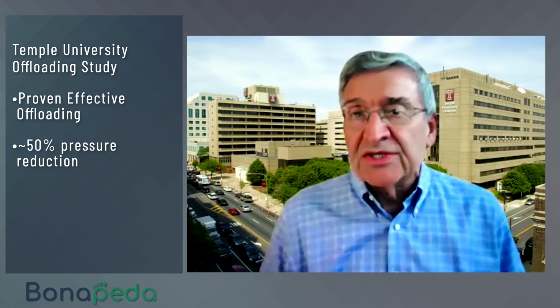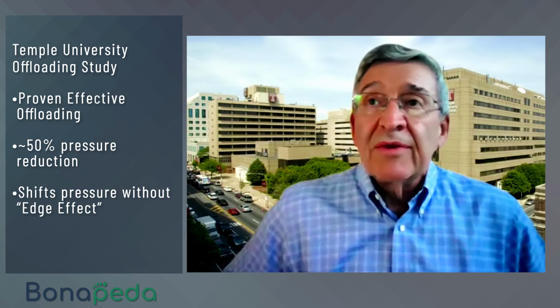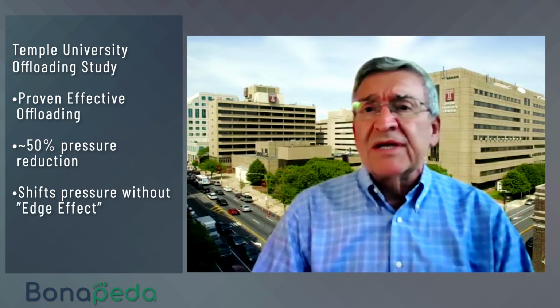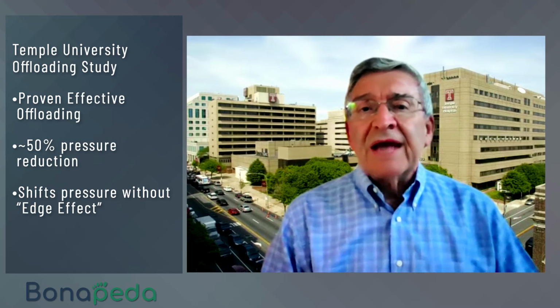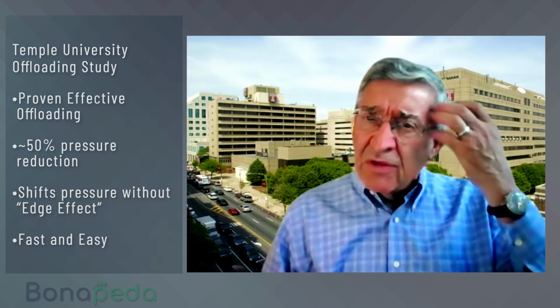Then when we selectively removed the materials, or the little pegs or pixelated sections of the insole, from underneath the ulceration, we were able to get upwards of, I think it was, 54% pressure reduction at the site of ulceration, which is an overall 19% improvement by just pulling the pixels out.